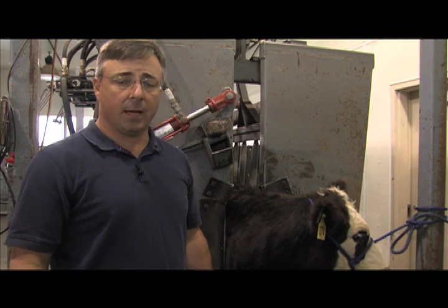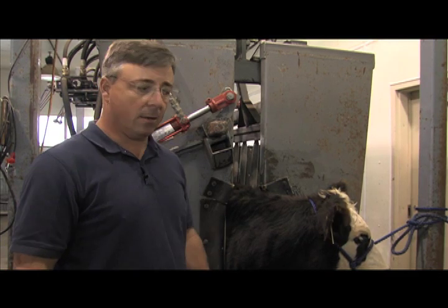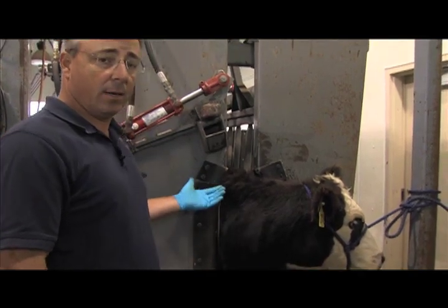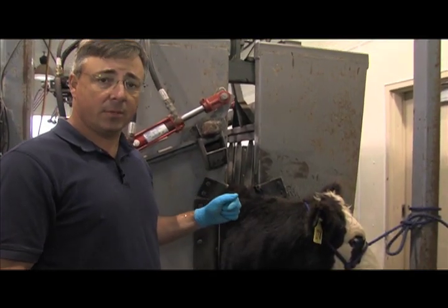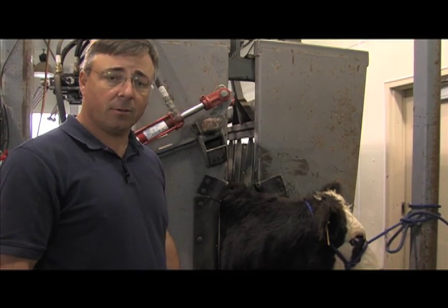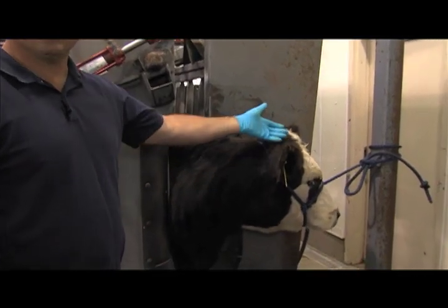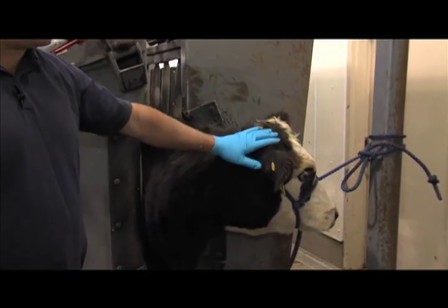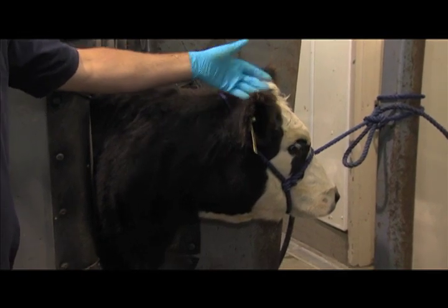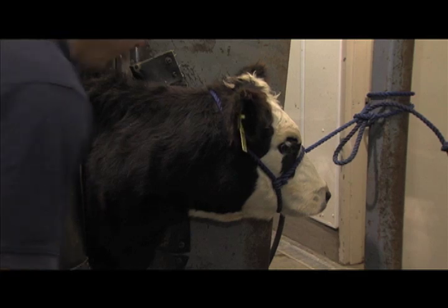Another area of the animal's body that a blood sample can be obtained for pregnancy diagnosis is the jugular vein. We've just demonstrated how to obtain a blood sample through the tailhead. Now we're going to demonstrate how to obtain a jugular vein sample. First, the animal needs to be restrained with its head one direction or the other. I've chosen to tie her off to her left.